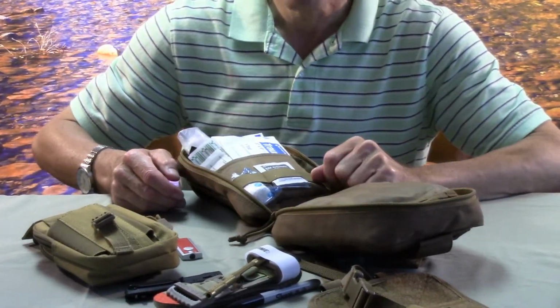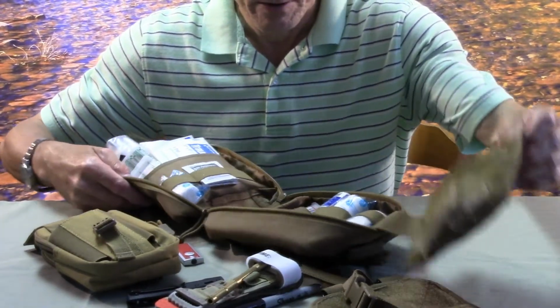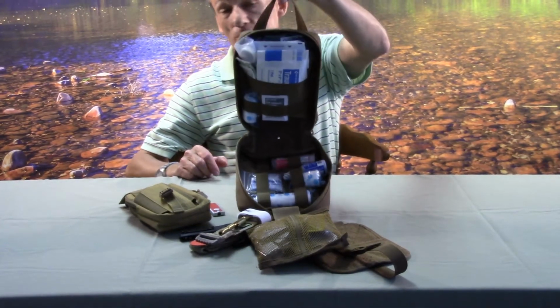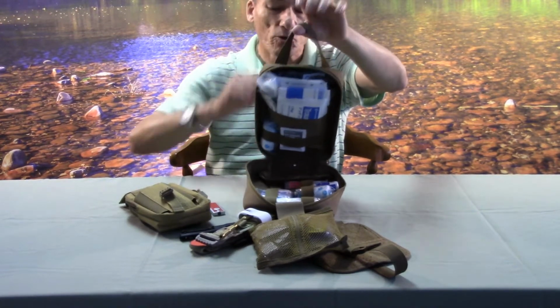Now let's get into the internals of the pouch. And I don't know whether it's all on screen or not, but the way it's designed is you could hang it up on a tree branch, for instance, hang it up on a rear view mirror if it'll squeeze over one.